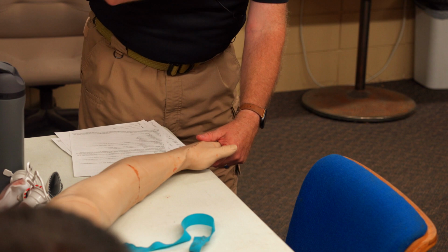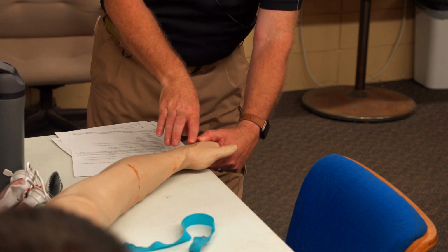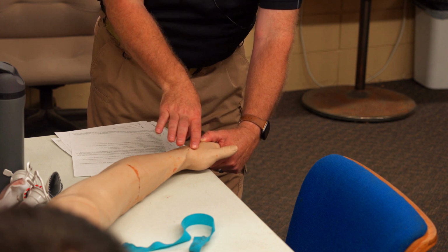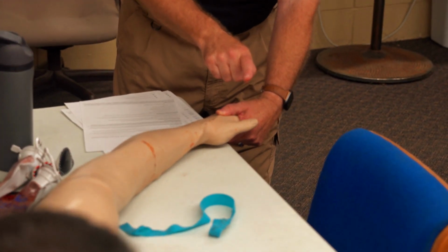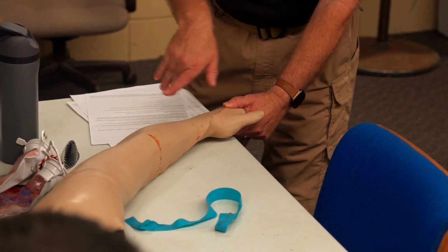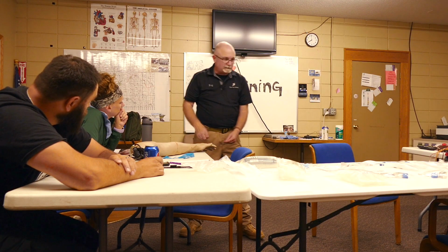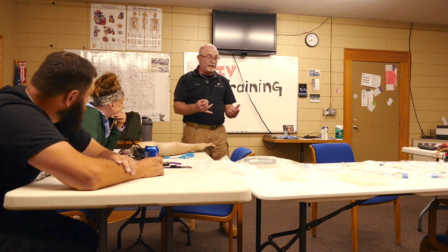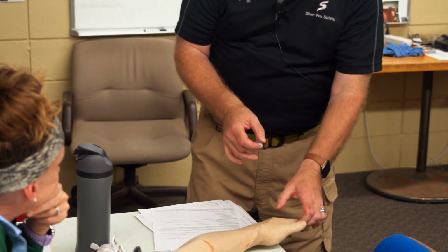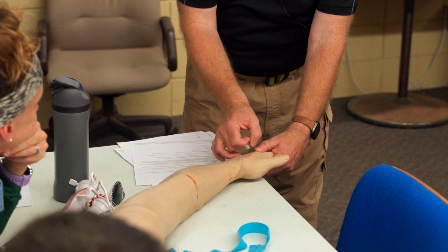There are different schools of thought. You're either going on top of and straight in, or sometimes coming in slightly from the side. Going from the side, if it runs away from you, you just chase it and it's going to stop eventually and you go in. If you're going straight over the top, it might sneak off to the side. For me, and again it's a preference thing, I'm visualizing going all the way into the vein on my first strike.